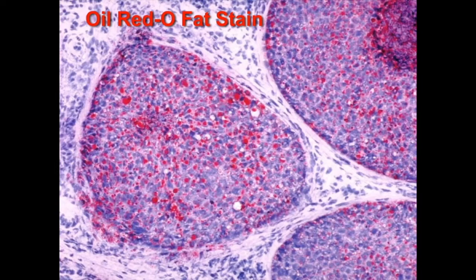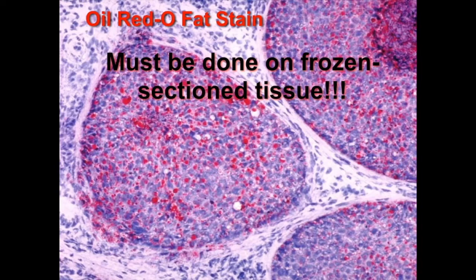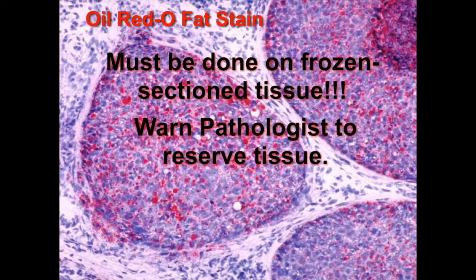Special stains for fat, like the oil red O, confirm that the vacuoles are composed of fat. Of course, this has to be done on frozen sections because paraffin-embedded tissue doesn't contain fat anymore. It gets dissolved out during processing. So these have to be done on fresh frozen tissue. Again, this stain really isn't done by ophthalmic pathologists that often.